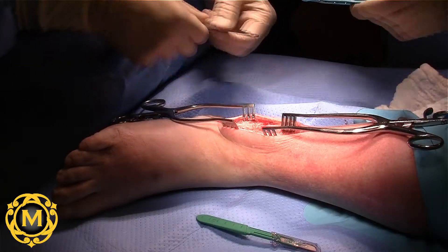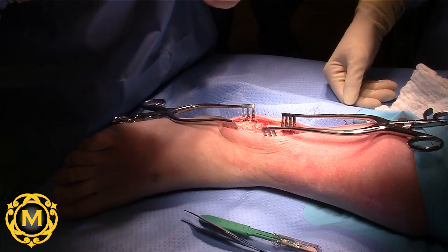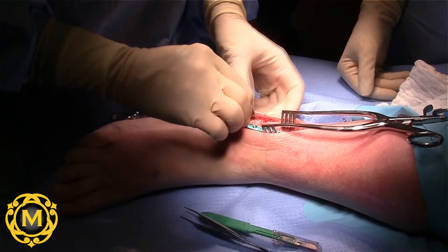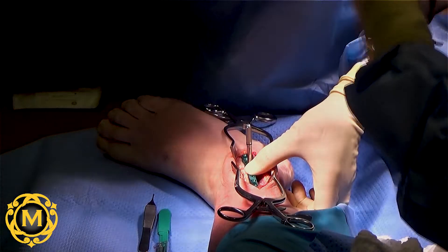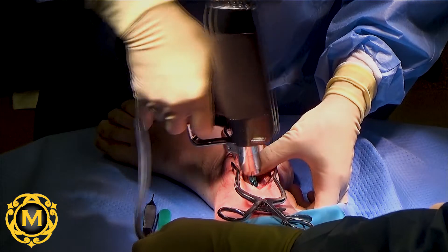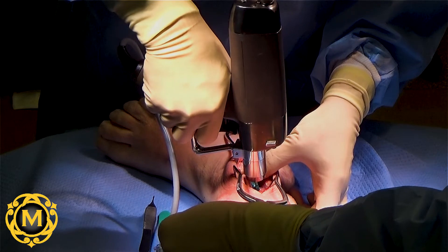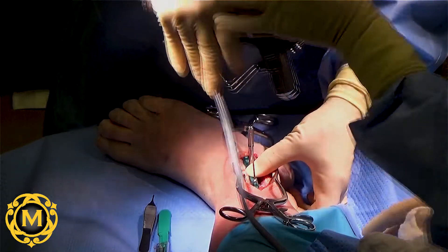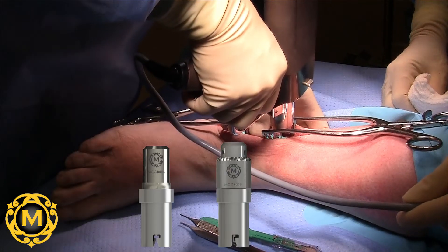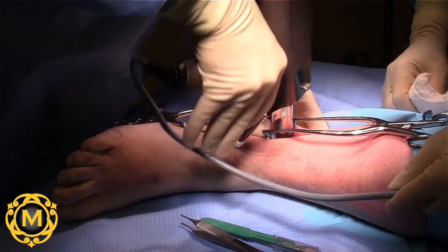The surgeon selected a right-sided, 5-hole, 86-millimeter Acumed lateral fibula plate and soft placed it in the surgical site to confirm its appropriateness for the application. The IntelliSense drill, equipped with its universal pin driver attachment, was used to secure the plate to the bone with a 0.062-inch olive wire. The universal pin driver attachment is available in the IntelliSense universal chuck set. Other available universal attachments include standard AO, keyed, and keyless chucks. Please note, universal chucks are not enabled with sensing technology.